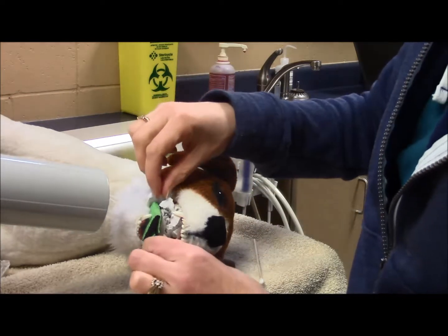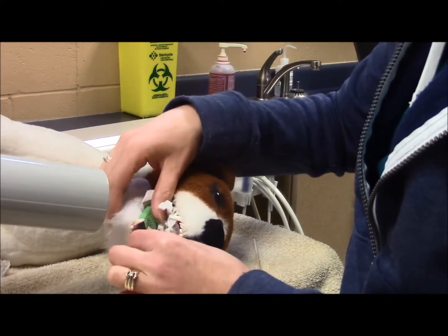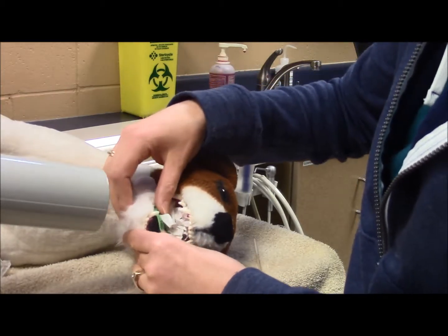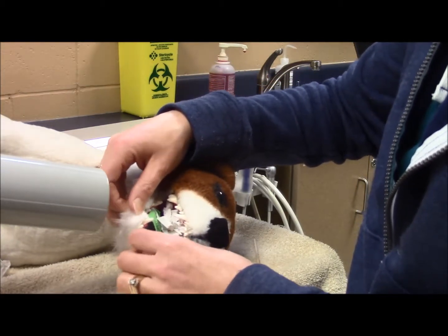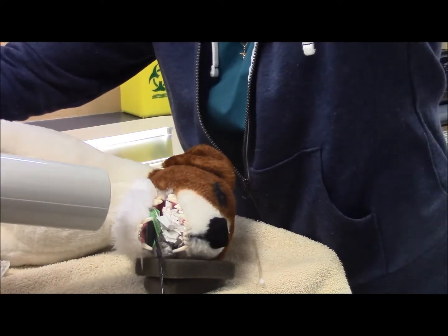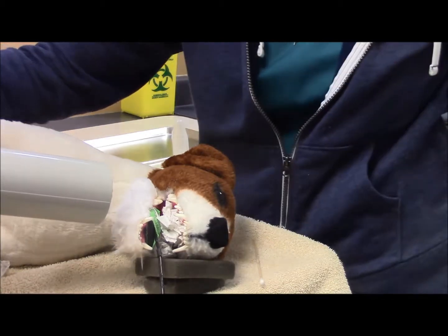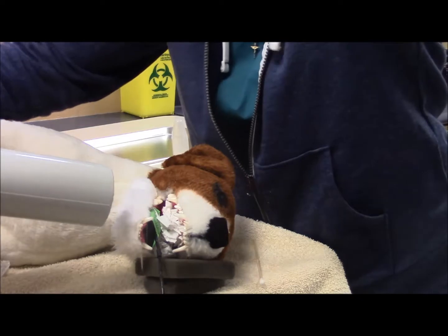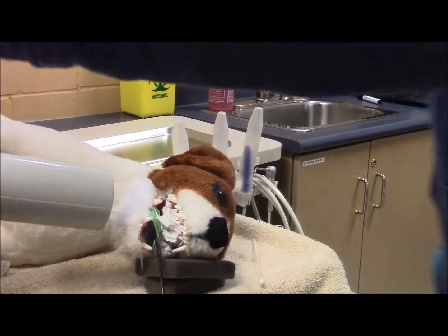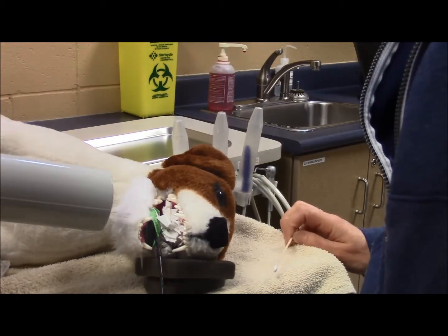So what I'm going to do with my sensor is I'm going to take it off the crown entirely, lay it flat on the floor of the mandible, just reposition my paper towel so it's laying flat right now. And then what I'm going to do with my cone is I'm going to just move it slightly distally, centering over where the apex of that tooth should be. It's still at the 15-degree angle. I should still be aimed at my bisecting angle already. And then it should be set up to image the apex of the tooth for the second radiograph.